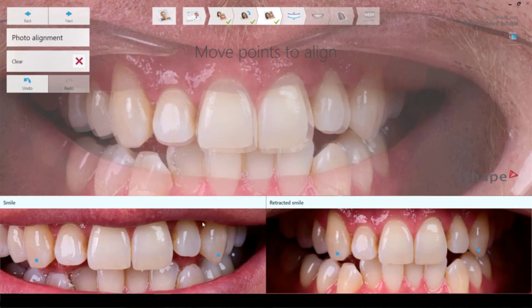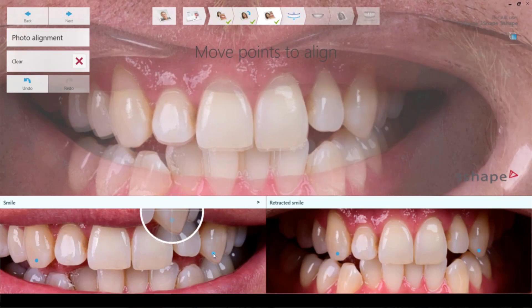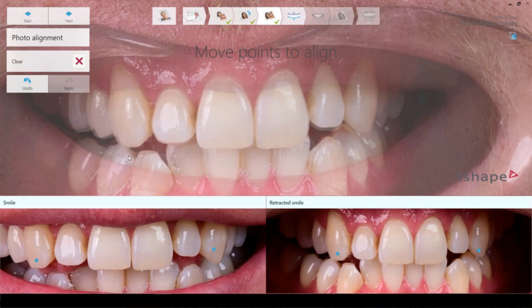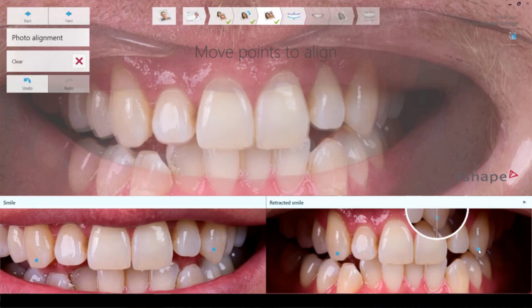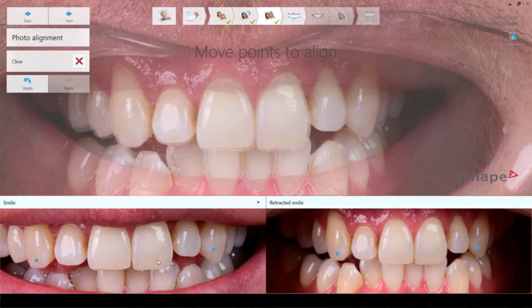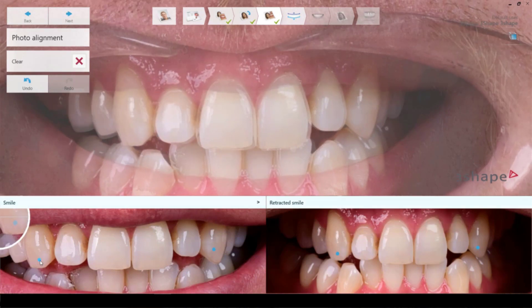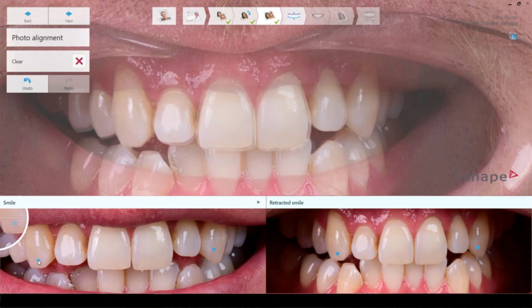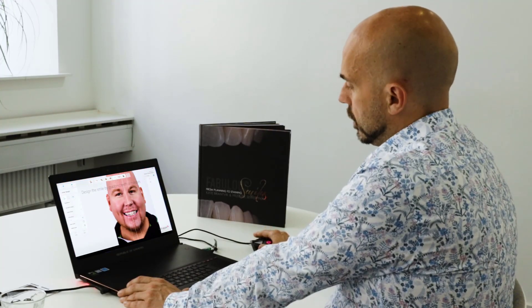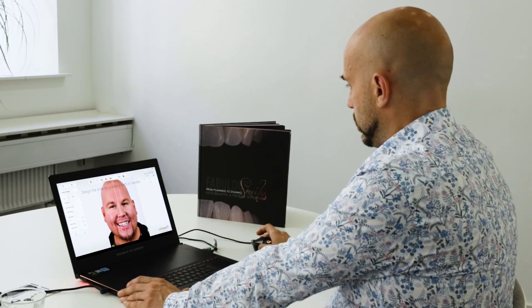The trick here is to have photos taken at the same time so you don't have photos from different days, because it's going to be hard to have the same angle. Then you just move these points a little bit — you will never get a perfect match anyway, but you'll get a decent match. Then we press next and now we can see the patient.